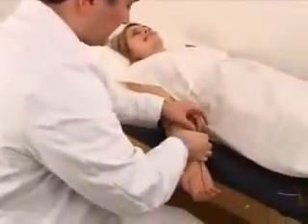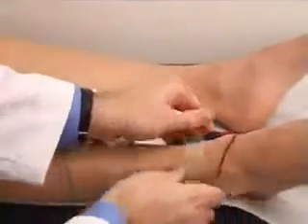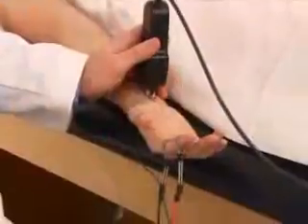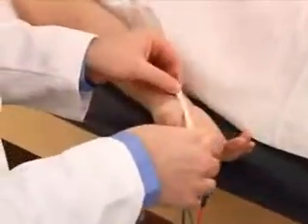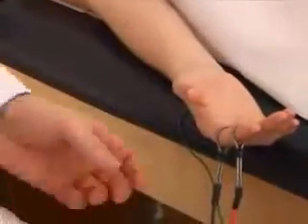In the assessment of more complex disorders such as brachial plexopathies, testing of the medial and lateral antebrachial cutaneous nerve is required, while testing of the saphenous nerve is necessary in the evaluation of femoral nerve disorders. As the EMG test progresses, the examining physician customizes the test according to the recorded responses. Each and every test is tailored to the patient's needs.